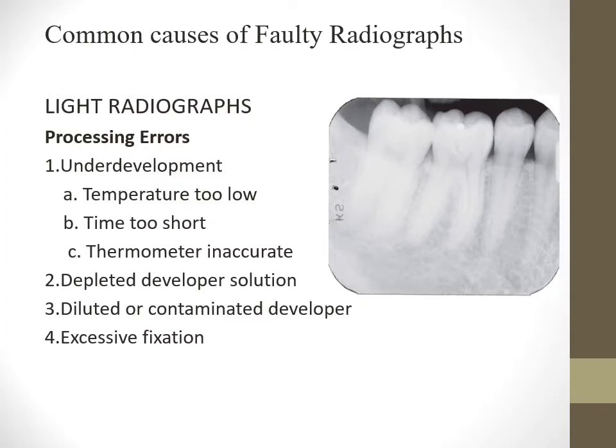Coming to the common causes of faulty radiographs, we come across faulty radiographs in intraoral periapical radiography. What are the common causes? The first is the light radiograph. When you take a radiograph, it might appear lighter. What is the reason for this? It could be due to processing errors.